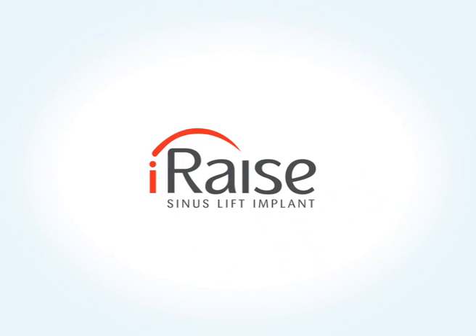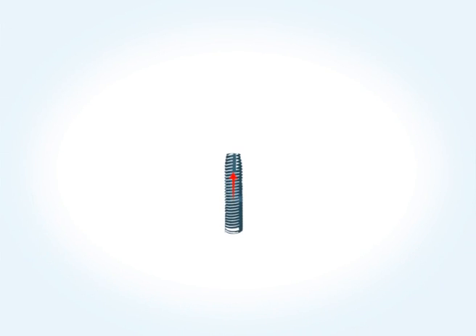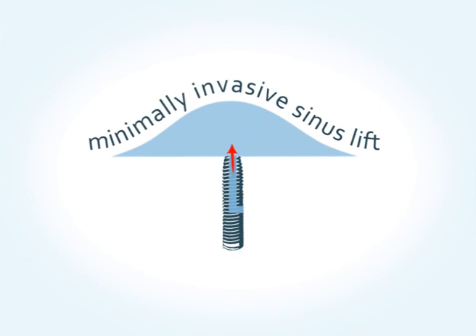I-RAISE Maxillent Sinus Lift Implant provides a minimally invasive solution for the sinus floor elevation procedure.